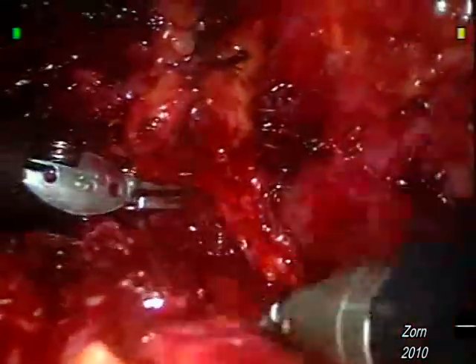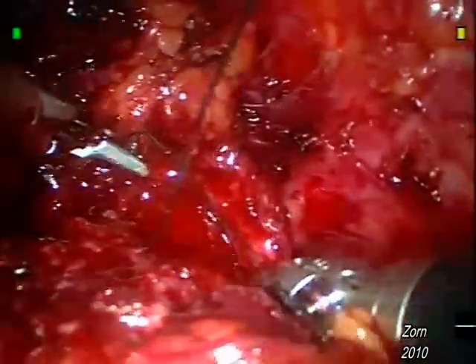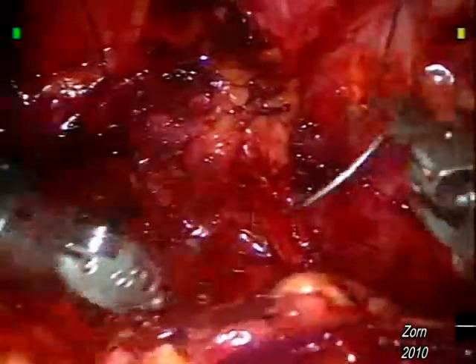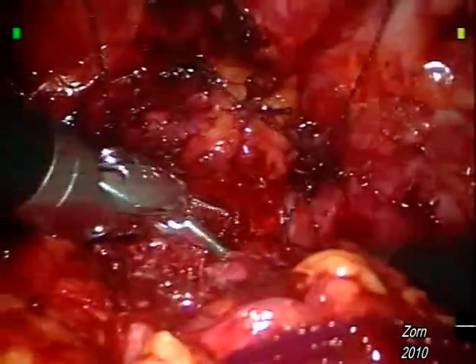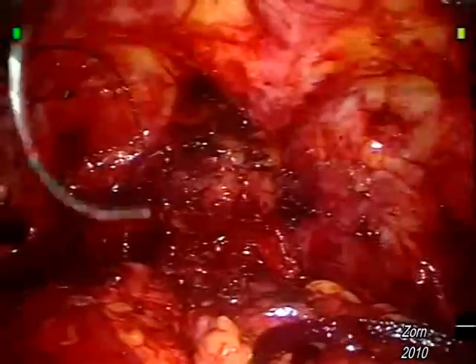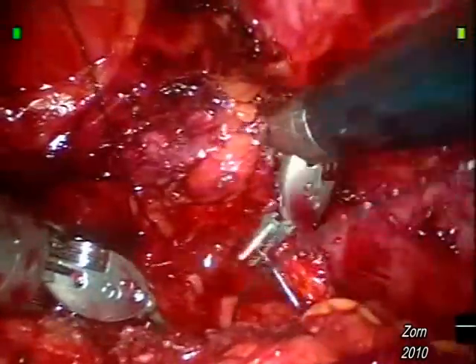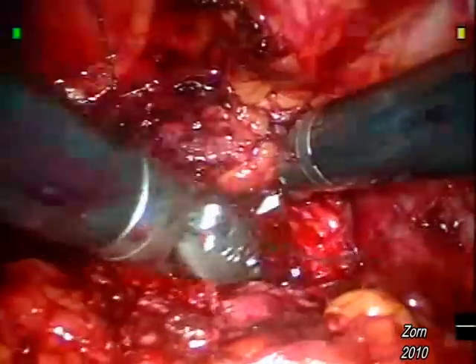We now begin the right-sided anastomosis with the initial bite using the right-sided suture — once on the bladder and now on the urethra, with care not to injure the nerve tissue. It is also important for the surgeon, especially at these initial bites, not to take too large of a bladder bite and to be very cognizant of the ureteral orifices, the tubes which drain both kidneys. Failure to do so may incorporate them in the anastomosis and lead to urine leak or an obstructed kidney.